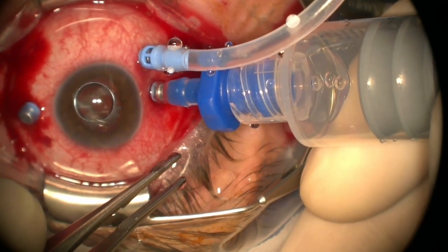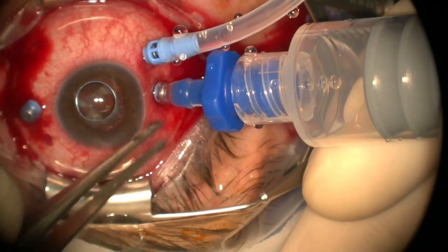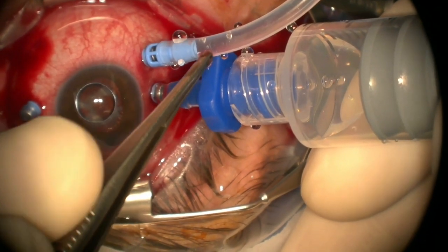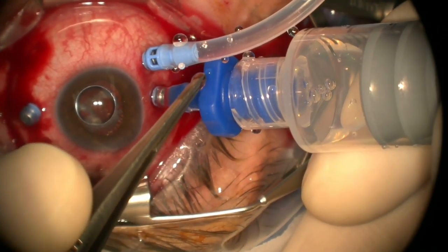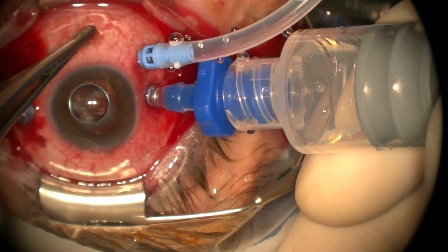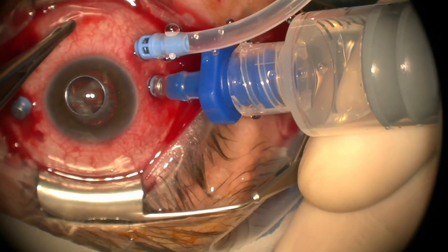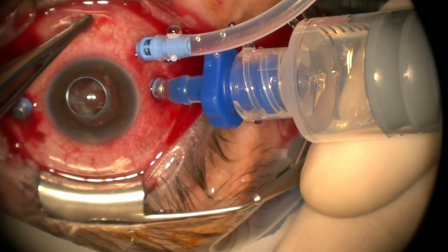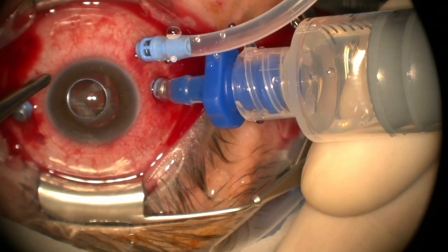Just a little bit of patience. And this is oil in here. Yeah, can you get that higher? So it pushes the oil on this line. So it got backed up into the infusion. And to push that oil out, we had to raise the bottle pressure, went up to 60. Because we want to push that oil in so we can get the eye firm back up. And so we use the irrigation to help us keep the eye firm, encourage the oil evacuation.